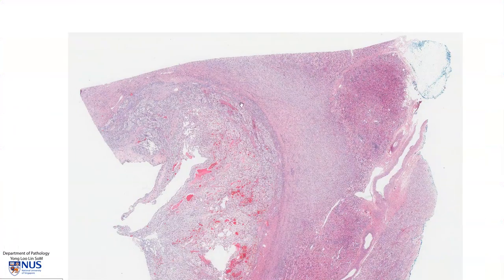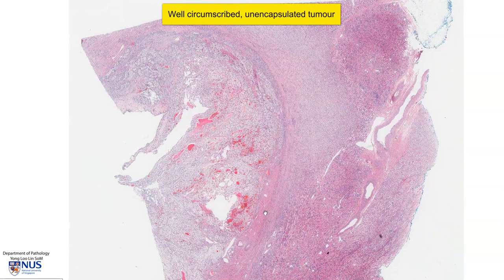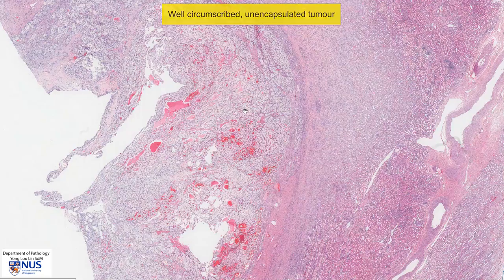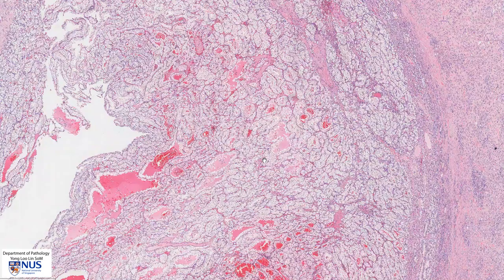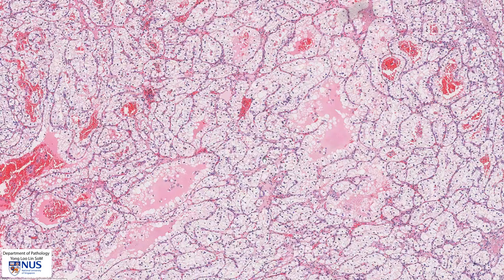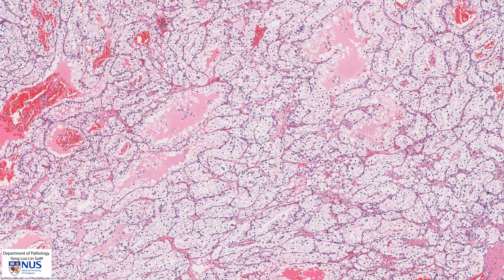Moving on to the area of the tumor, we can see at low magnification that it is relatively well-circumscribed. However, there is no well-defined fibrous capsule.